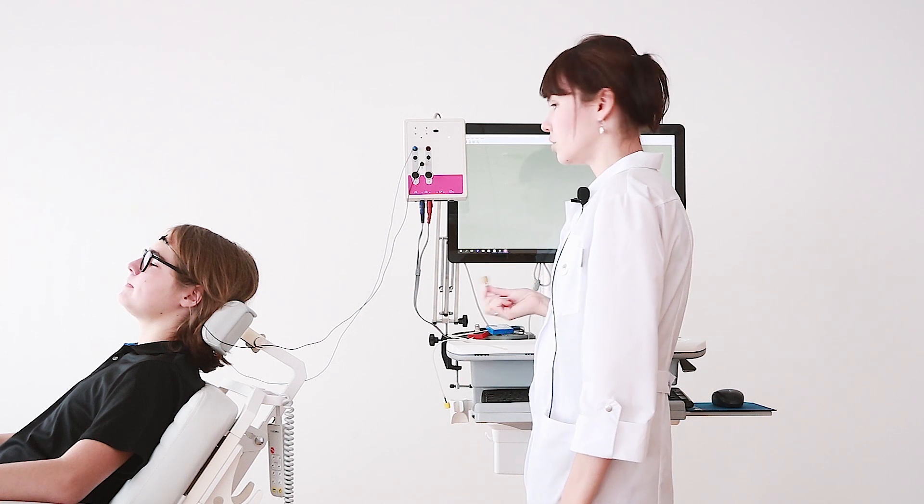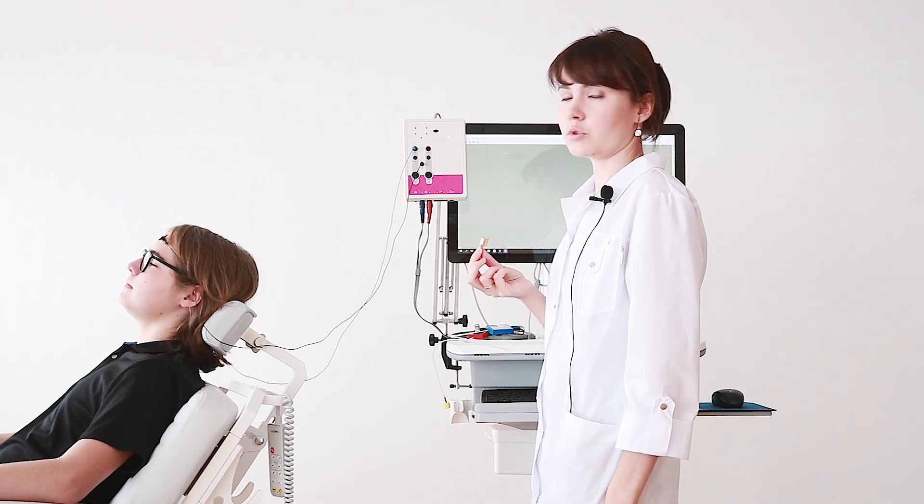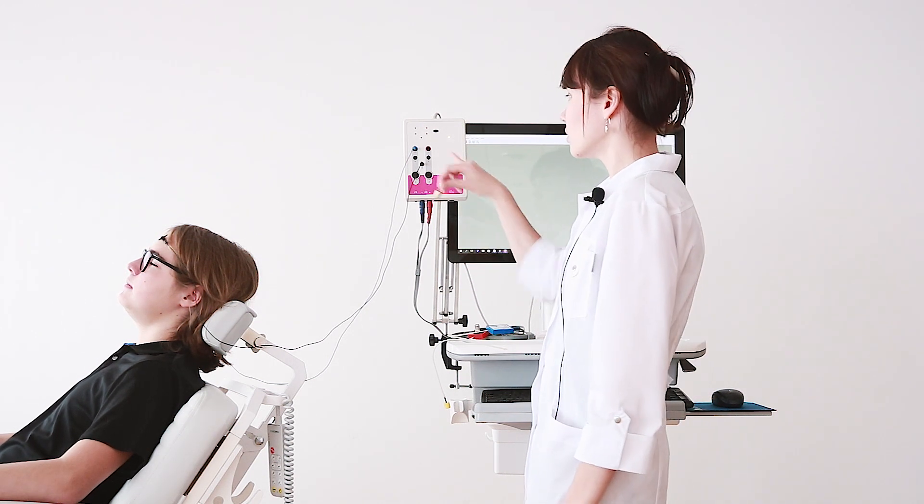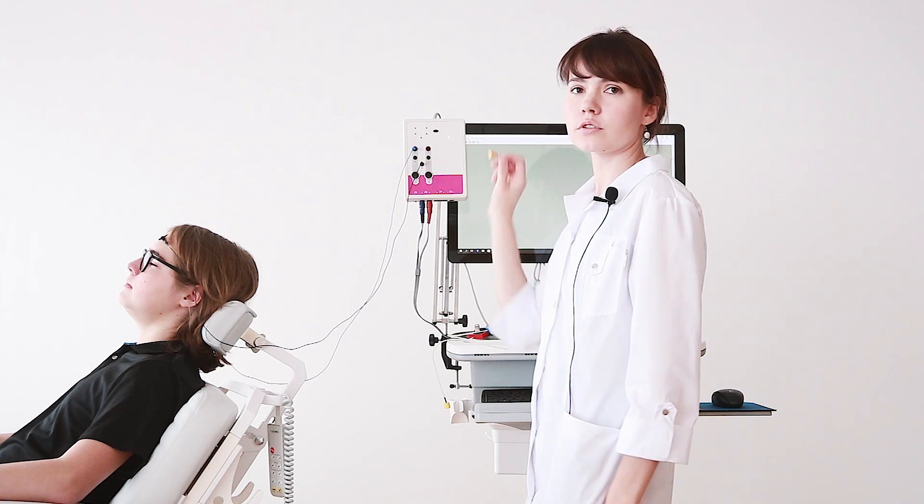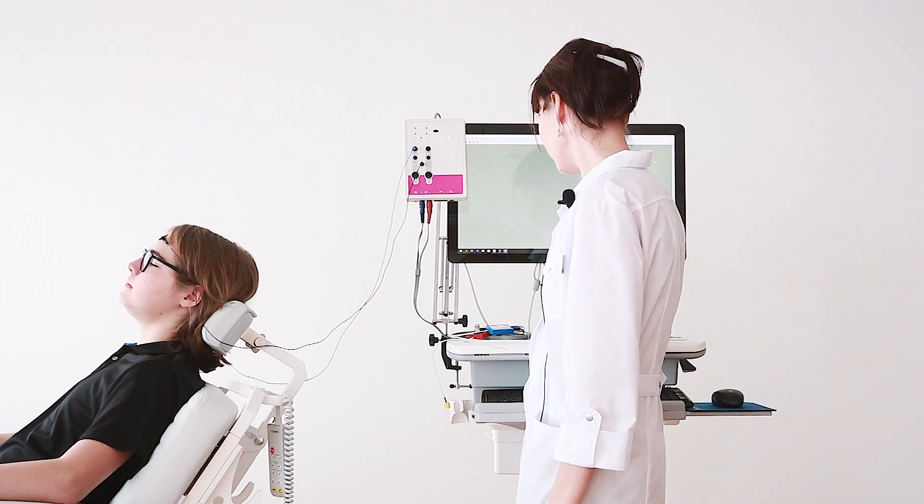If you want, you can use two tip-trodes for each ear and apply connectors to the two channels of the amplifier.